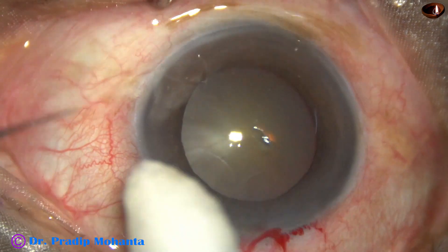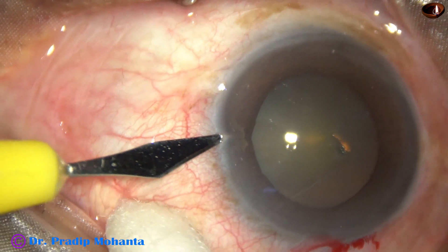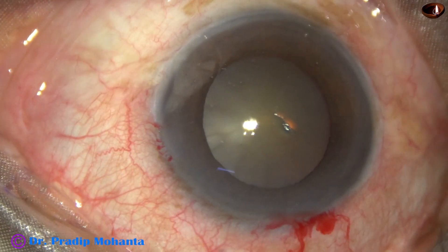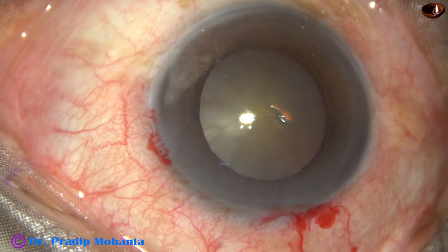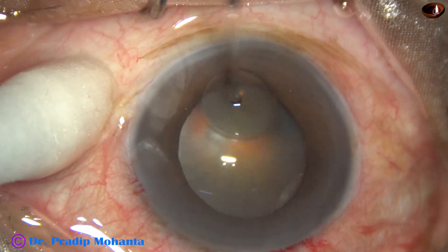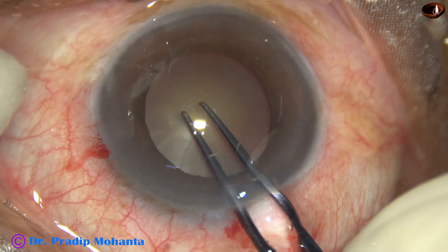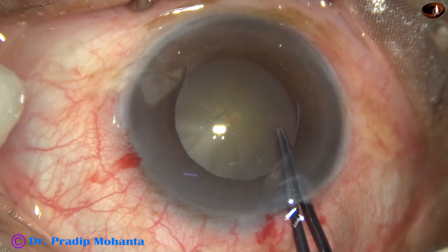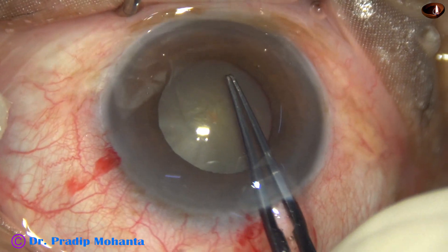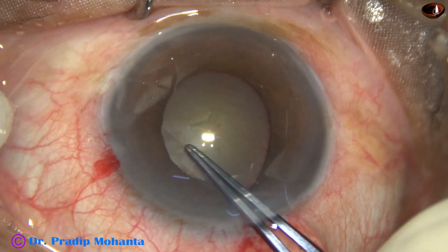So we can get an adequately sized capsulorrhexis in this case. A side port is made on the left side of the main incision, about 3 clock hours away. And now, capsulorrhexis is done with the help of capsulorhexis forceps. The capsular tag is raised and guided anticlockwise, in such a way that we get an adequately sized rhexis.